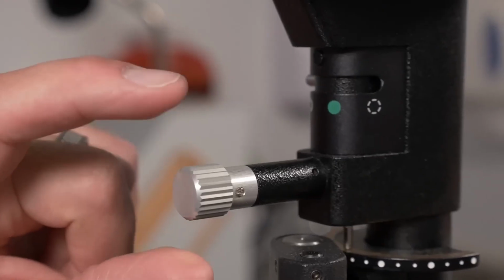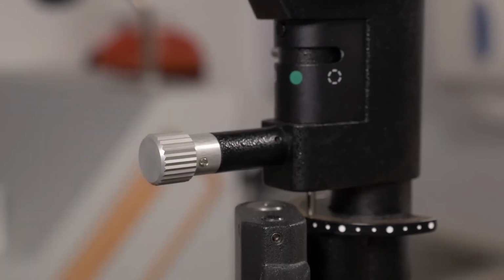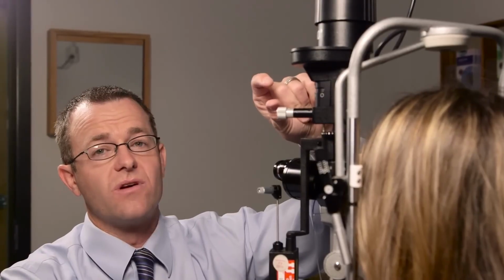So let's say that you're measuring the size of a corneal abrasion, or more importantly for me as a retina specialist, if you're looking at the size of a hyphema, which is blood buildup in the anterior chamber, you can actually measure the size of that hyphema or how tall it is, and then record that down so that later on you can record that, oh, it was 5 millimeter hyphema this week, and then a week later it went down to 3 millimeters. So obviously having less hyphema is better than more hyphema, so you can track that. That's especially important with looking at corneal ulcers or corneal abrasions or things like that. But in the retina world, we use it especially to measure the size of hyphemas or blood in the anterior chamber.